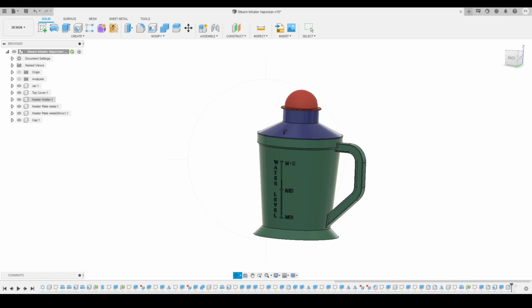Here you can see all the components we got: jar, top cover, heater holder, heater plate metal, and cap. So we got multiple components over here. If I show you over here, you can see these are all the multiple components.